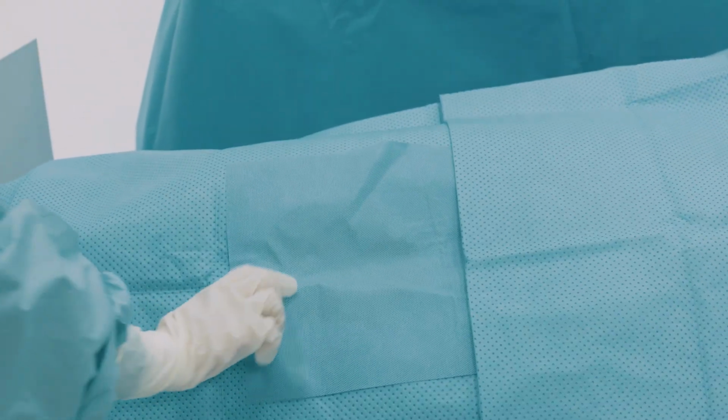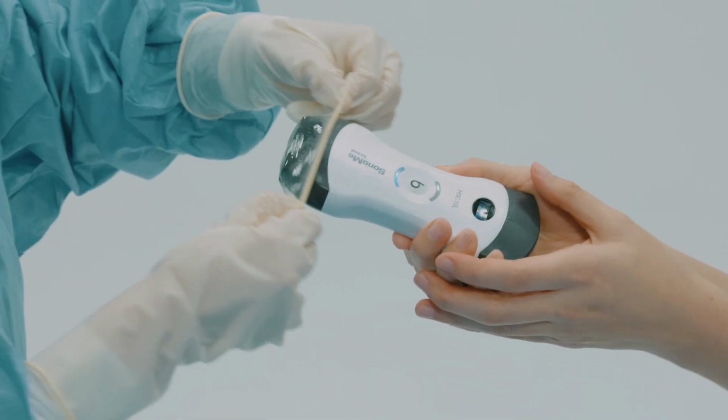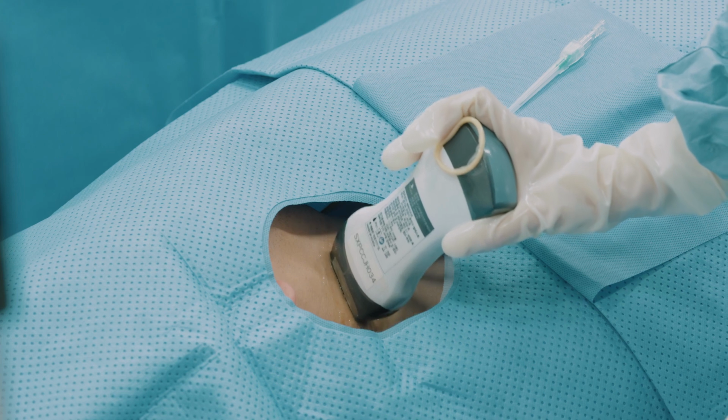CVC placement requires aseptic measures with ultrasound guidance, including site prepping, wearing sterile attire, and covering the ultrasound probe. The application of a sterile probe cover ensures a secure seal over the transducer, making the process quick and effortless due to SonoMe's wireless design.